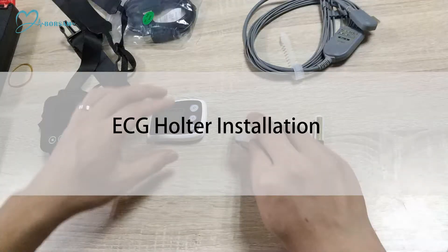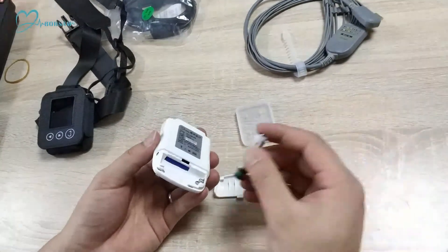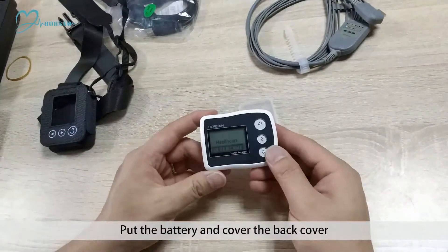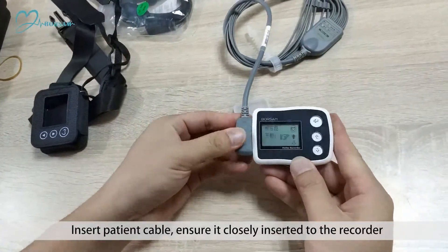ECG Holter Installation. Step 6: Open the device back cover. Step 7: Insert the SD card. Step 7: Put in the battery and cover the back cover. Step 8: Insert the patient cable, ensuring it is closely inserted into the recorder.